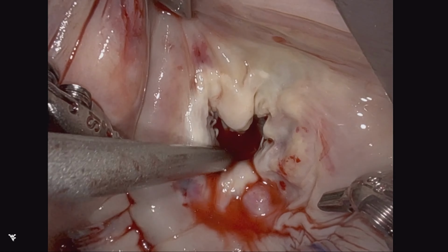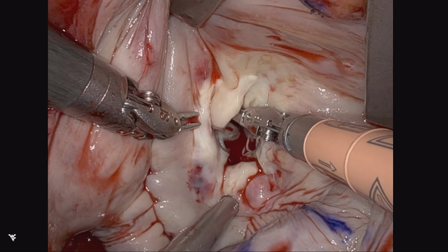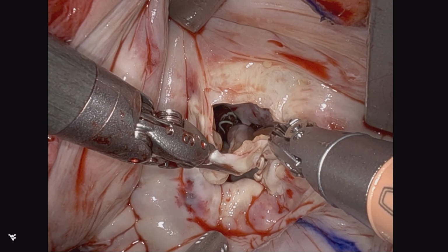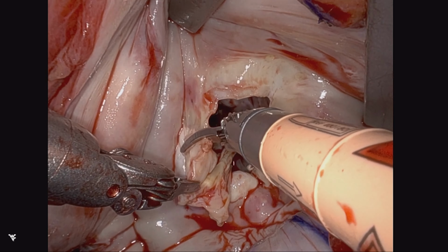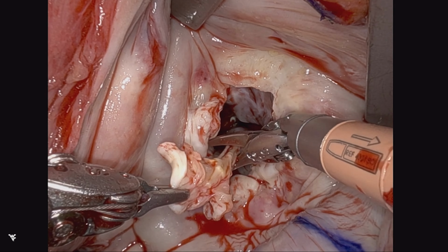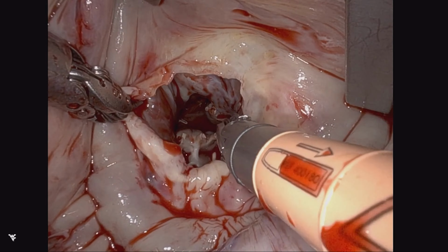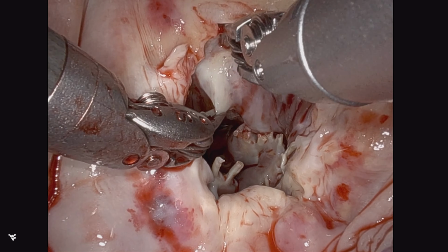So this is a heavily calcified posterior MAC. The anterior leaflet is small and restricted, and we have septal hypertrophy with LVOT obstruction. In this case, obviously, we're not going to preserve the anterior leaflet chordal groups due to the severe posterior leaflet disease and MAC, since we want to avoid systolic anterior motion or outflow tract obstruction at the final proceeding. I think we can avoid the MAC, but we're going to do a septal myectomy.